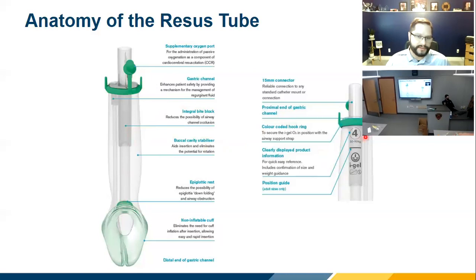If you flip the tube over, you'll see they put the size and the ideal kilogram weight range for that patient right there. Below that there's a position guide — a tooth marker, just like your King tube would have. Very similar.